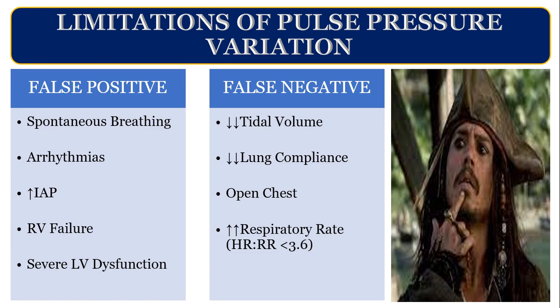Where you'll get false negative? Where there is a low tidal volume ventilation or the lung compliance is very, very low, because the pressure will not be transmitted to the pleura. Open chest and a very high respiratory rate. Sometimes in ARDS ventilation and a patient with H1N1 pneumonia, and Chitra was talking about the pregnant lady.